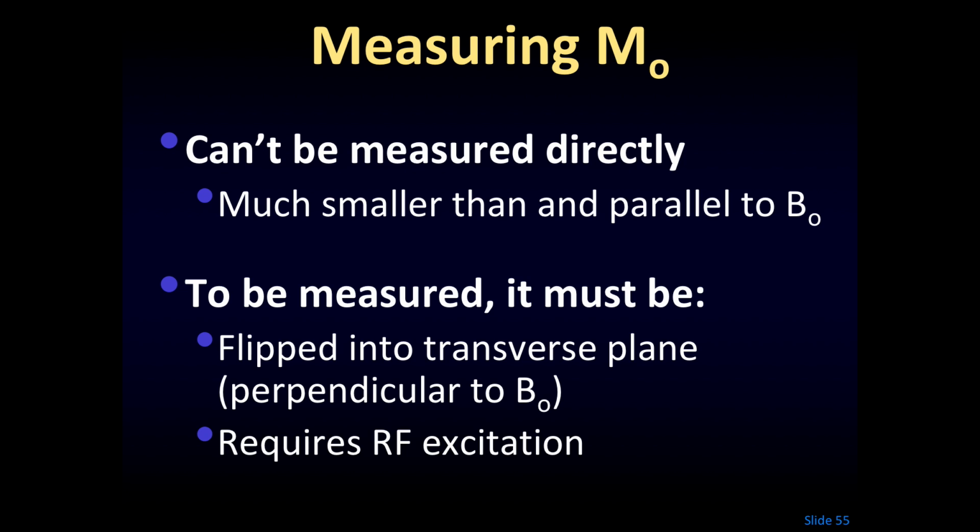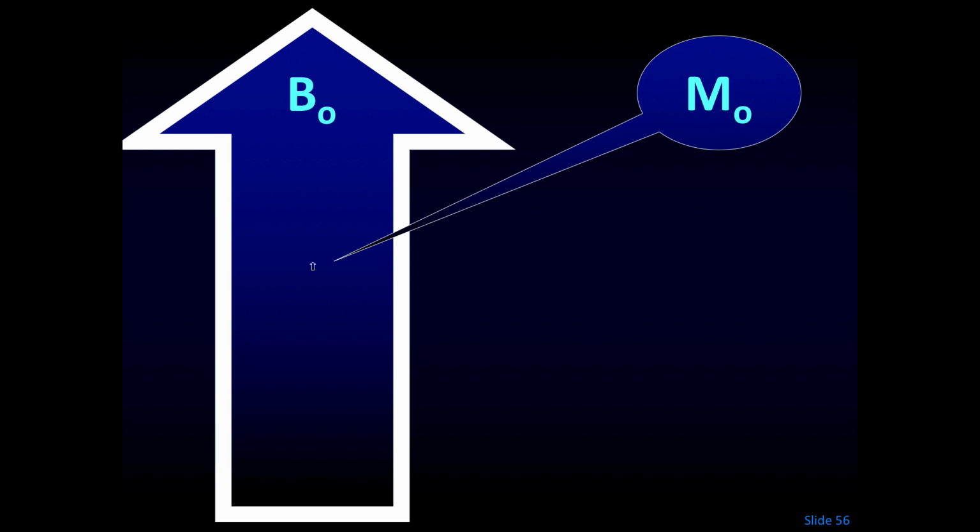What frequency? If you're at 1.5 Tesla, it's going to be TV channel 2. And if you're at 3 Tesla, air traffic control. So it's either going to be 63 megahertz or 127 megahertz. And when we apply radio frequency waves, we can take your puny little magnetic field and we can tip it. Now, some of you probably didn't notice that that little arrow tipped, but maybe Jen noticed. She's the only person close enough. So trust me, that little arrow just tipped.